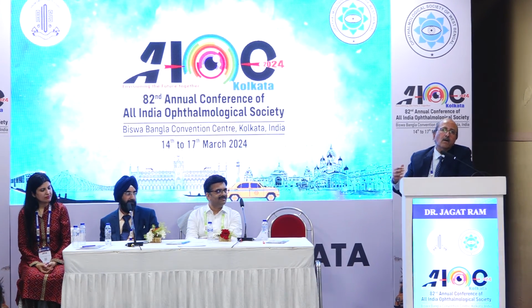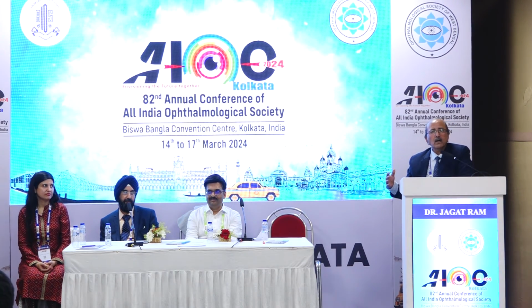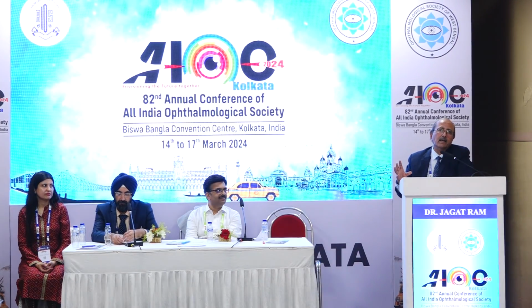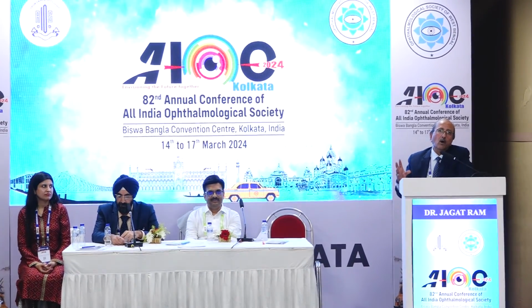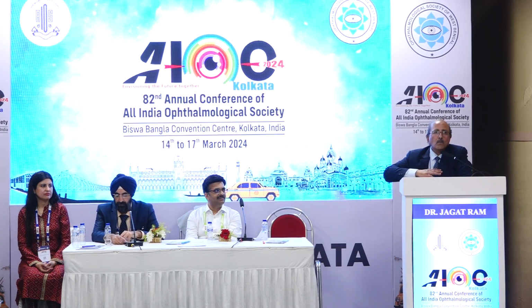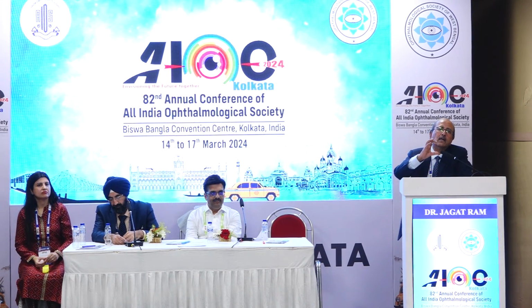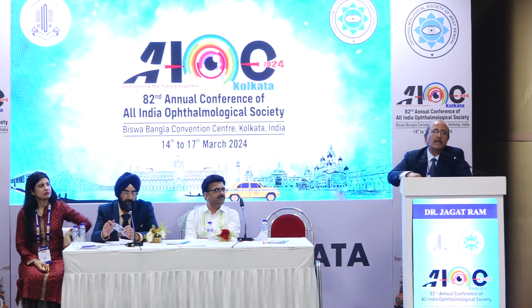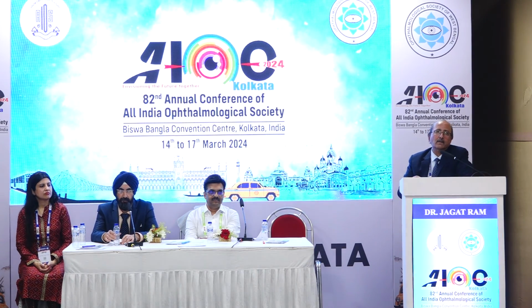Then we used other formulas, SRK2, SRK-T, Barrett, and recently SRK-T and Barrett. That is also with under correction, keeping a balance of how much under correction. It should not be too much, just to keep +6, 7 diopters of hypermetropia, which will create a big imbalance. So you have to adjust that part.